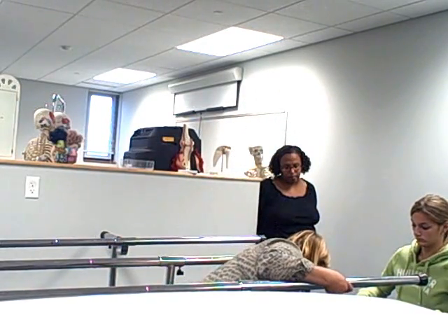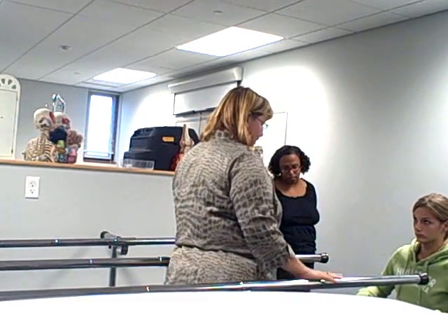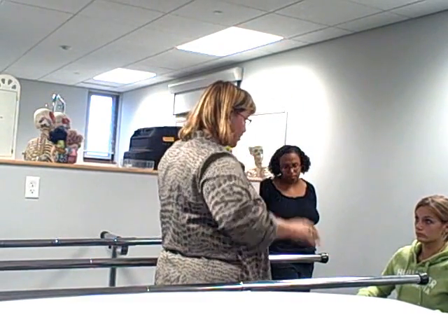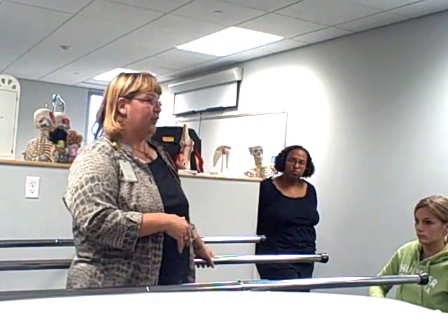Okay, we're going to do a couple of things today, patient. I want you to get up and moving around. I need to demonstrate some things before I get you up. Do you remember what the four things are to demonstrate? How to get up from the chair. How to turn at the end. How to turn to get back into the chair. And the gait pattern.